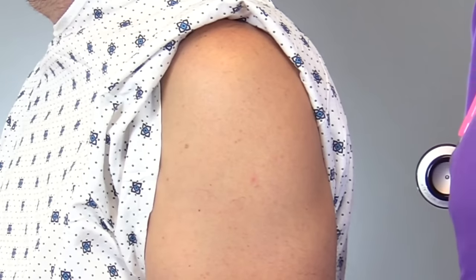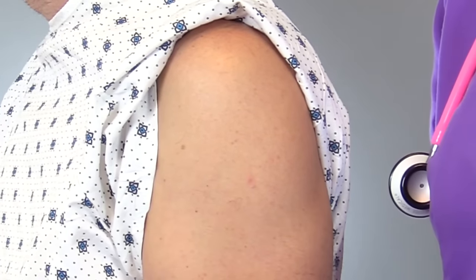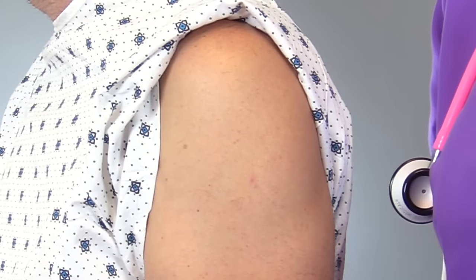You want to explain the procedure to the patient — what you're going to be doing and what you're administering to them. A tip: whenever I give vaccines, I always like to ask the patient if they're right or left-handed, because I like to give the deltoid IM injection in their non-dominant arm. If you've ever had a vaccine in your arm, it can get sore, so always try to take that into consideration. Before you give the injection, you can have the patient stand or sit. If your patient doesn't like needles, it's probably best to have them sit in case they pass out.